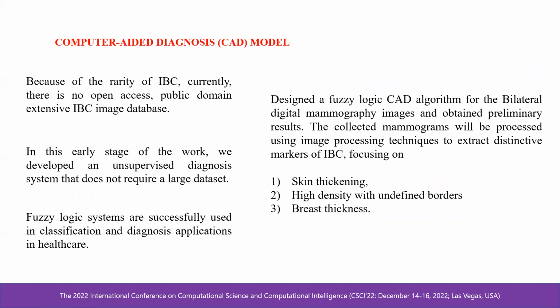Next is the computer-aided diagnosis model, which is in stage 5 in our mHealth system. Because of the rarity of IBC, currently there is no open access, public domain, extensive IBC image dataset, and it makes it impossible to design a supervised IBC diagnosis model currently.